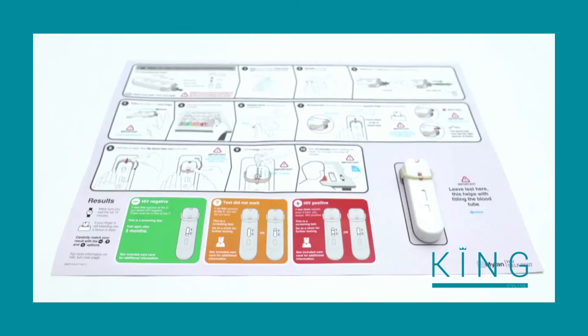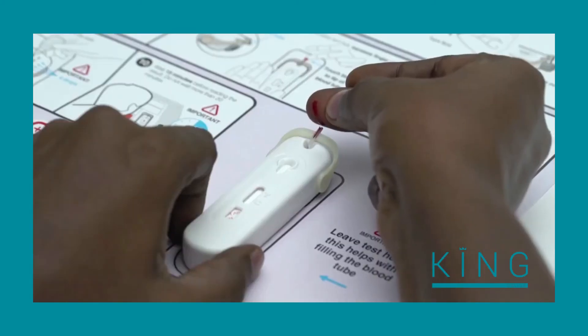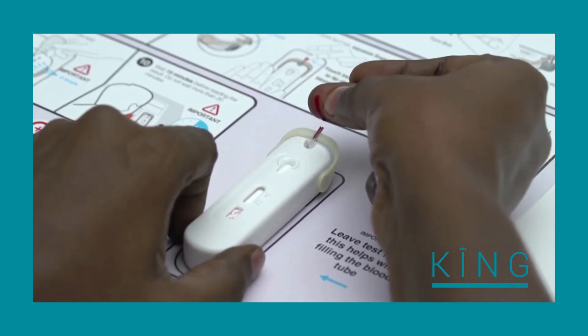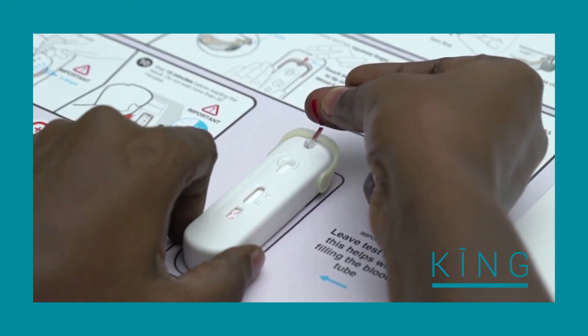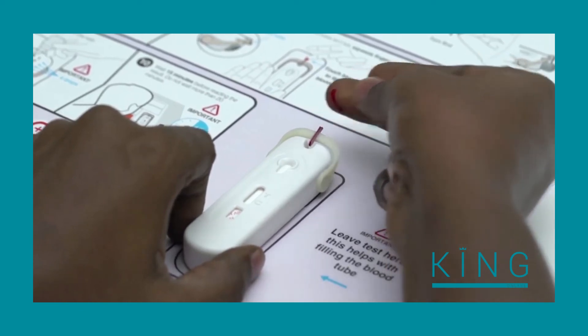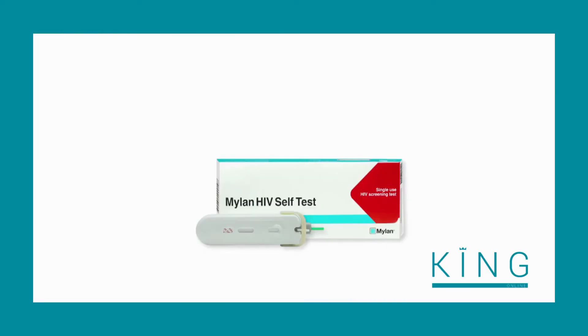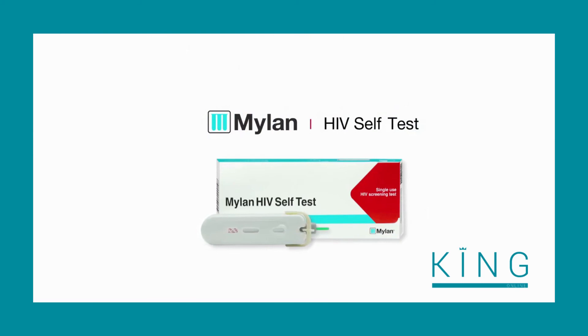The most important thing to remember from this video is that when filling the blood tube, keep the device on the table the entire time, hold your finger in a downward position, gently touch the blood to the tip of the tube, and avoid touching the tube with your skin. We hope that this video was helpful to screen yourself with the Mylan HIV Self-Test.